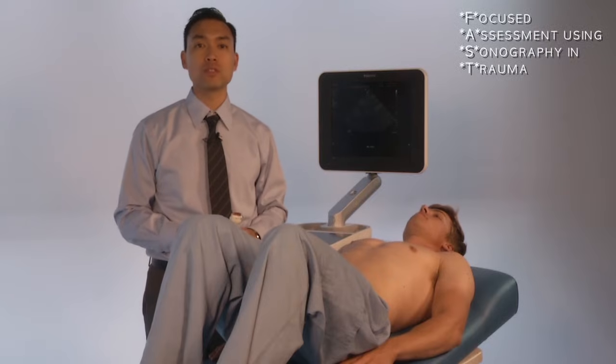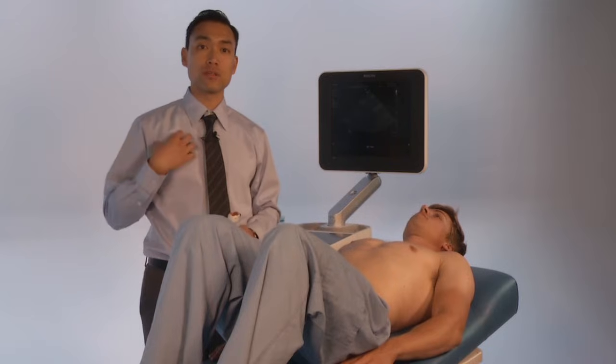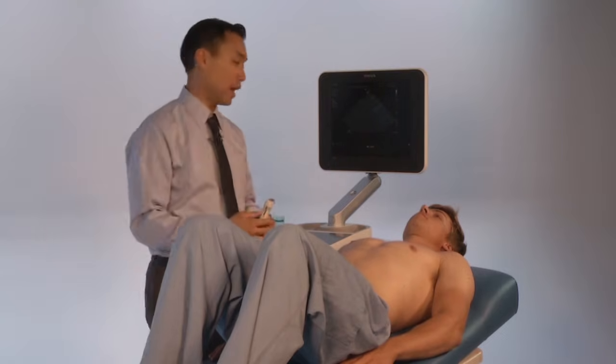So now we're going to go over how to perform the FAST scan. This is a scan that's used in trauma. It's called a focused assessment using sonography for trauma. You're basically looking for free fluid in the abdomen, around the heart, and in the chest, as well as looking for pneumothorax of the chest. So we're just going to go over the protocol that I use.